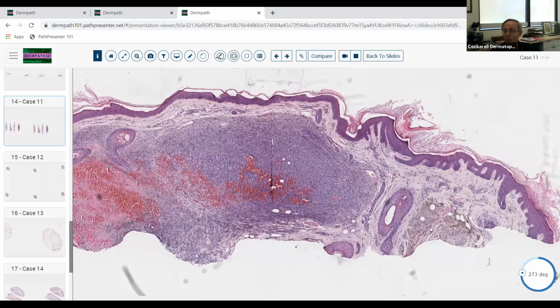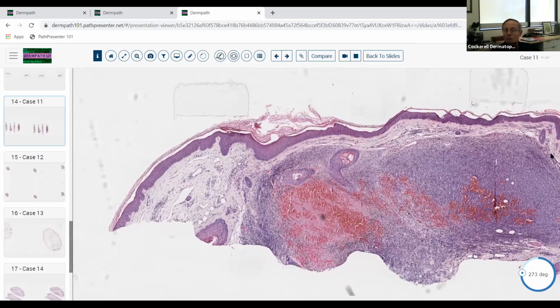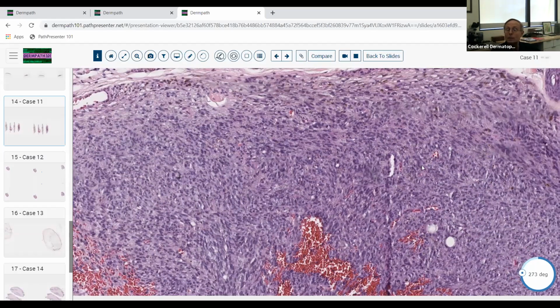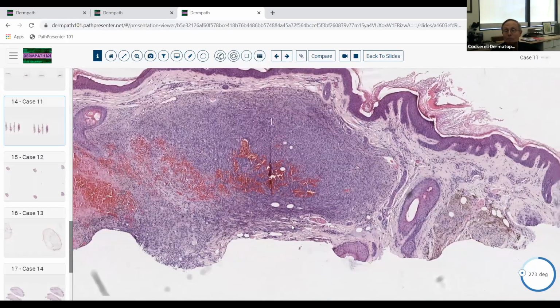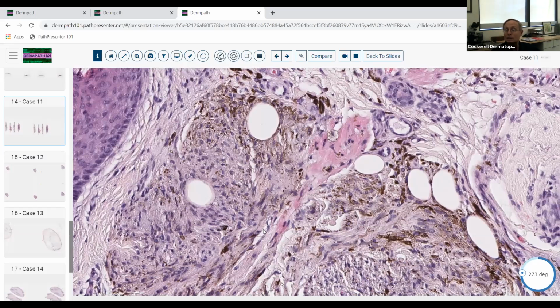You'll see an area of normal appearing blue nevus, usually a cellular blue nevus, and then in an area contiguous to it, you'll see malignant degeneration that looks like a melanoma, and it looks different than the blue nevus component. So here you've got this zone of necrosis, you've got the nodular melanocytic component, and if you just had something like this, without having melanin and some other features like that, you really might not even be sure what the differentiation is here because it's really pretty poorly differentiated, but it actually is associated with this blue nevus component. So we were able to make the diagnosis of melanoma that arose in association with a blue nevus.